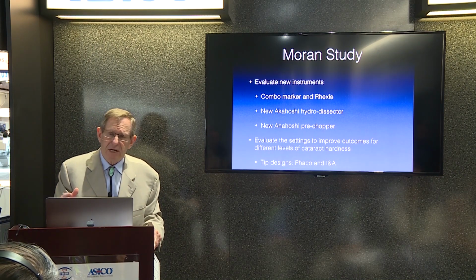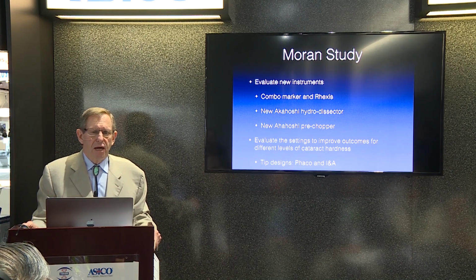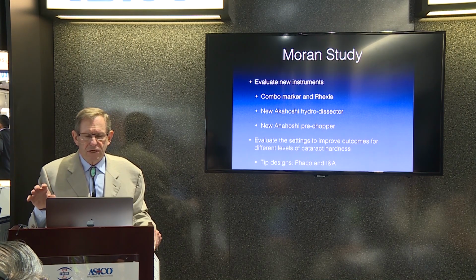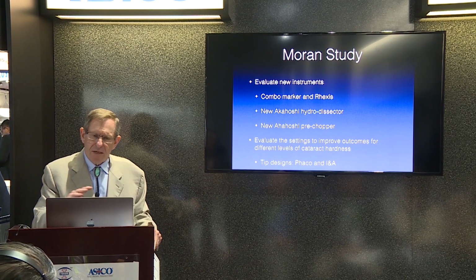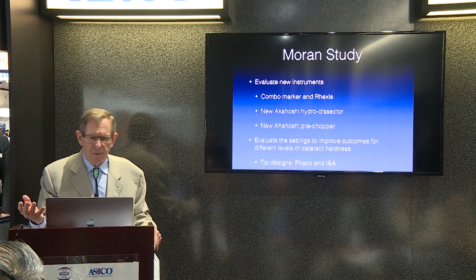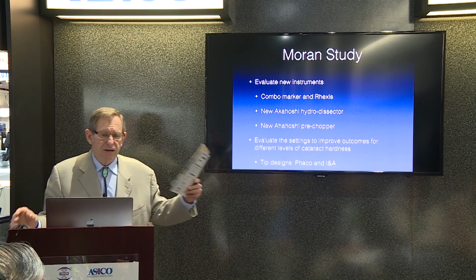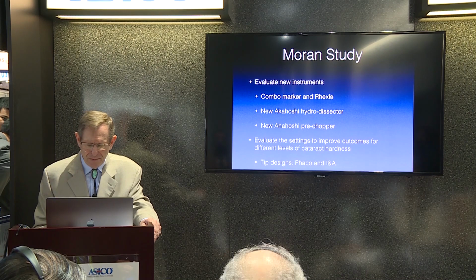And then again, the tip designs, which could be reverse Kalmans, straight Kalmans, sharp tips, Dewey tips, Packard tips, and many of these also have different diameters. The Packard reverse Kalman from MST is 0.9. It's small, and its flow patterns are going to be way different than the harmonics tip and some of the other tips. So that's why I think it's important for us all to really get a good idea of that. And I do happen to have that Akahoshi, so you can see it as it passes around. I couldn't get a picture of it.